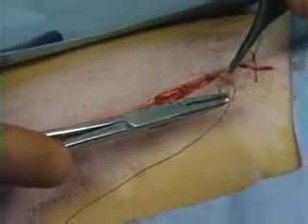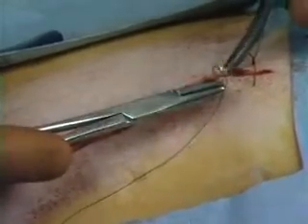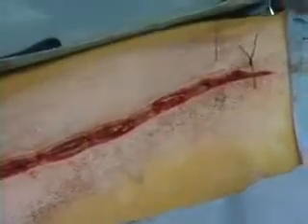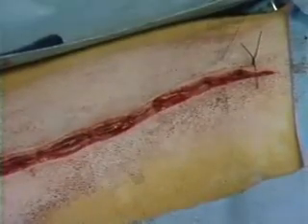This tape will cover techniques only. The student is encouraged to review current surgery textbooks for specific suture patterns and their indications. After viewing this tape, you will be able to describe nine listed suture patterns and classify them as to whether they are simple interrupted or continuous, and each suture pattern's tendency to oppose, evert, invert, or tension relieve.